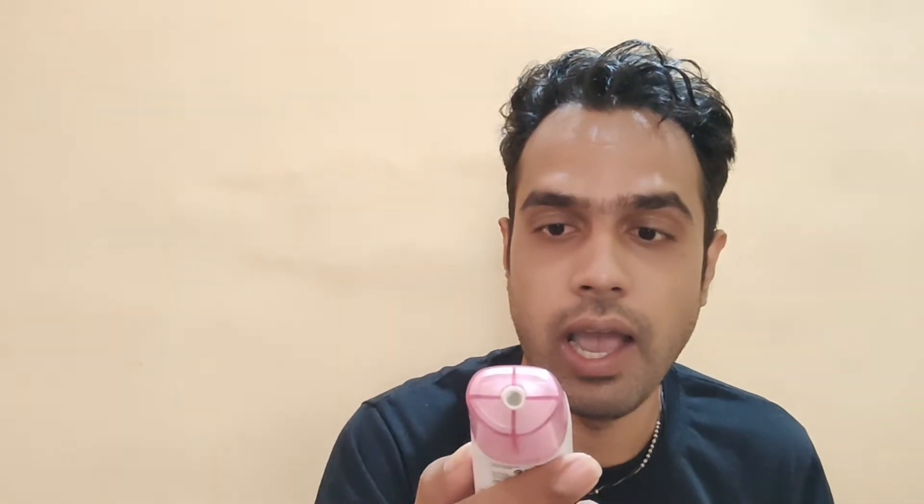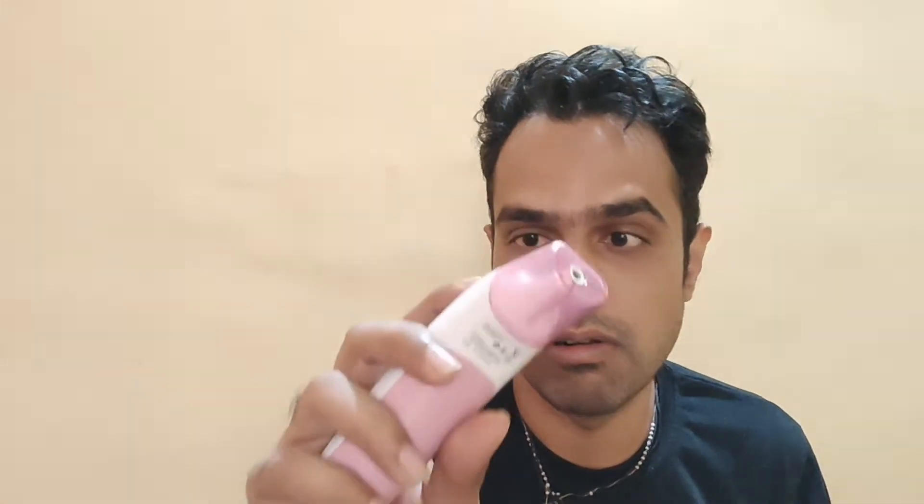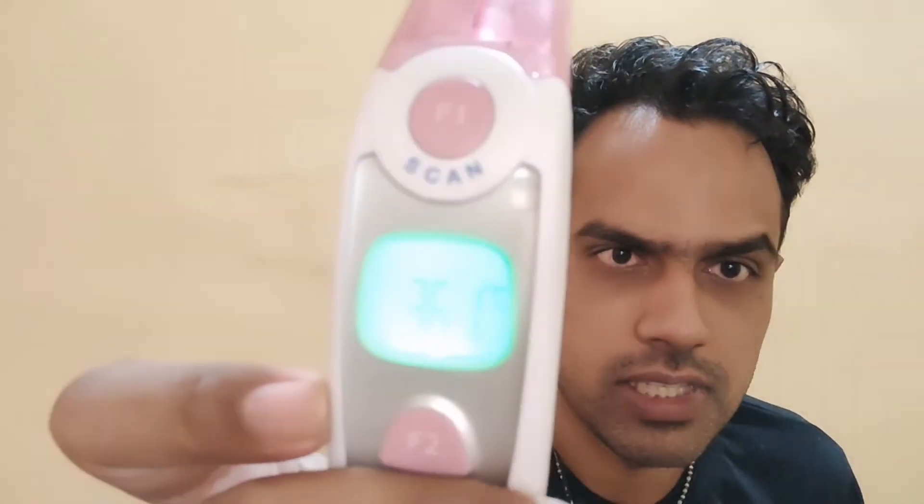Now that it's off, let's check the reading — it will be in Celsius. And there we go: 36.7 Celsius, 36.1 Celsius. The reading is now coming in Celsius.